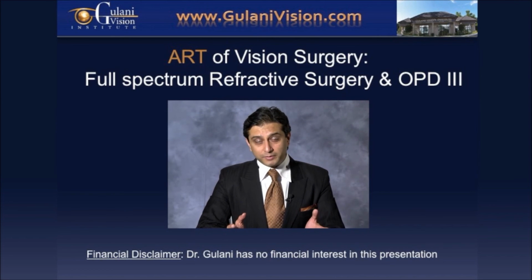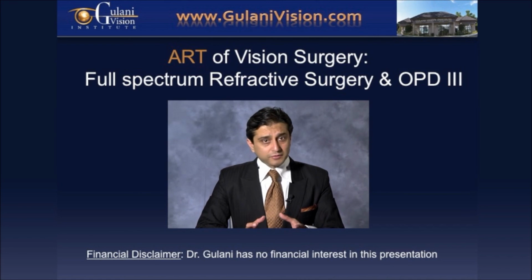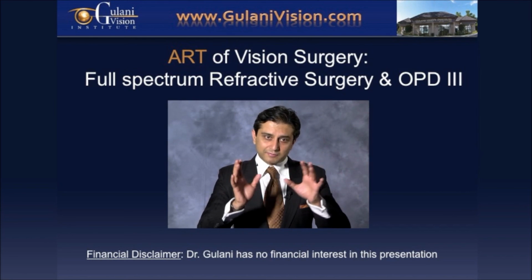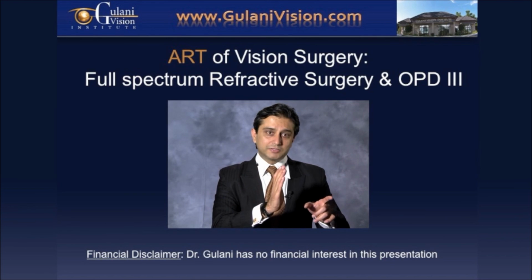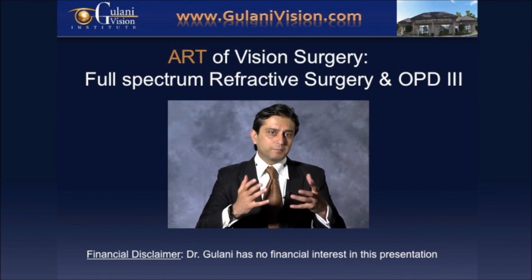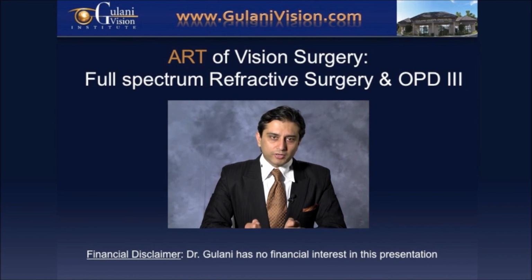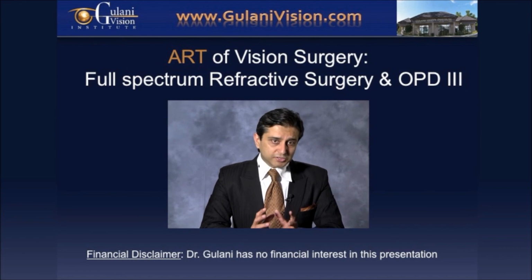with refractive surgery. So I believe a technology which takes little space in your office is at one station giving you so much information that you can take all that information like mathematics and decide which element of the eye is creating the problem, how many elements you need to correct in single or staged process, bringing the patient again with that desire of best vision potential in every case. So with this technology, I do believe we come the closest we can in today's time to reach that goal.